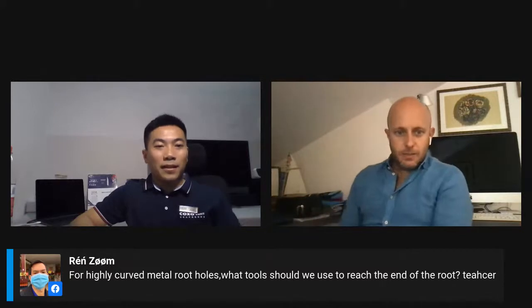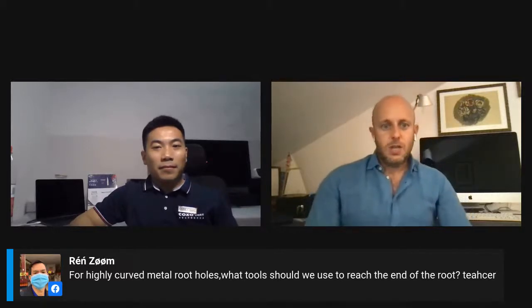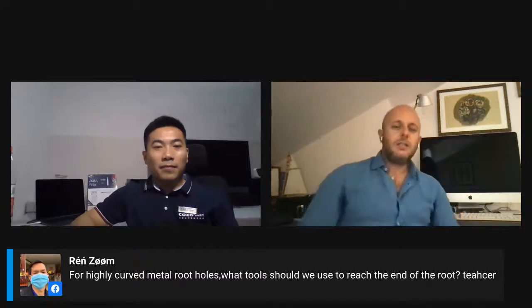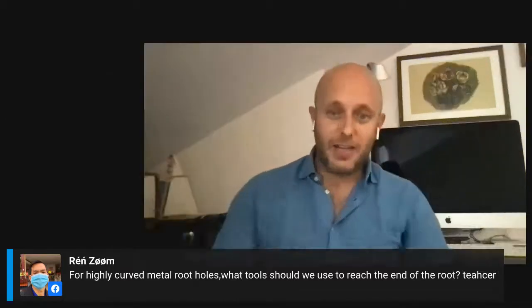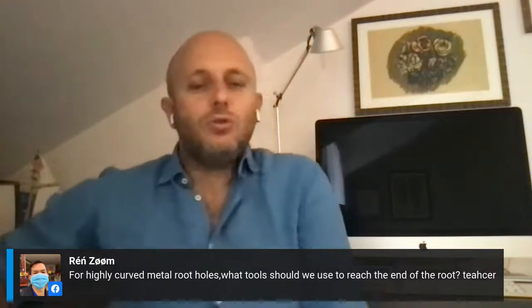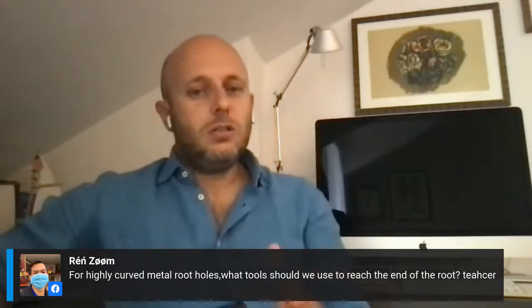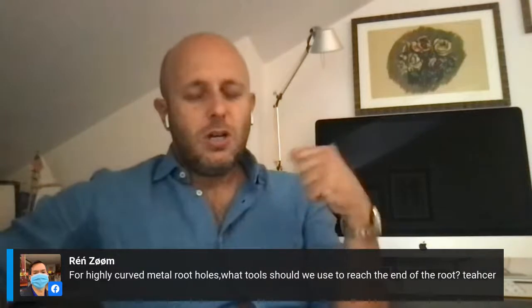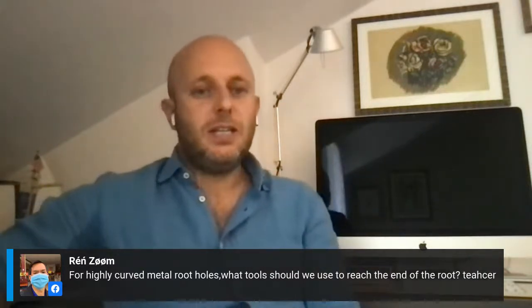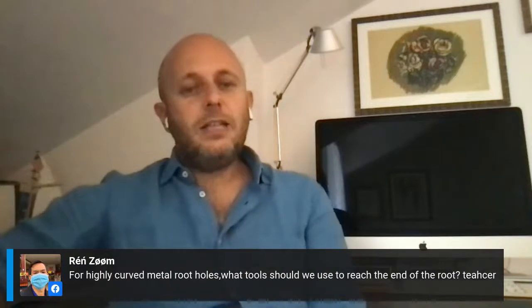Okay, so for the next question: what tools should you use to reach the end of the root? Okay, for sure, the most important step is the pre-flaring of root canals. So we have to do our best with stainless steel pre-curved small files in order to reach the apical third. Then today we have at disposal new endodontic files made with martensitic nickel titanium alloy that are very, very flexible, much more than traditional nickel titanium files.